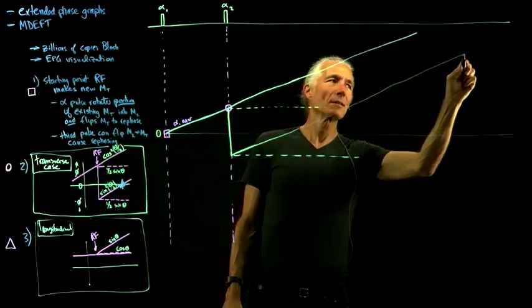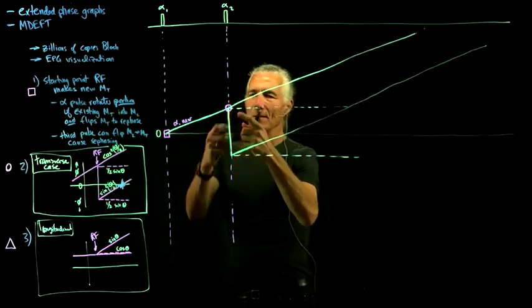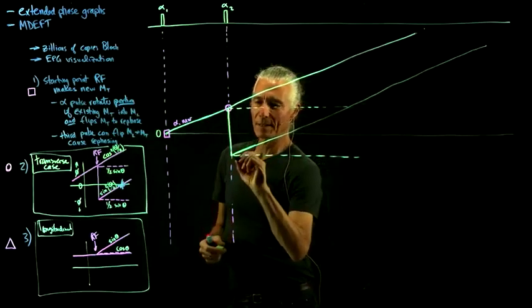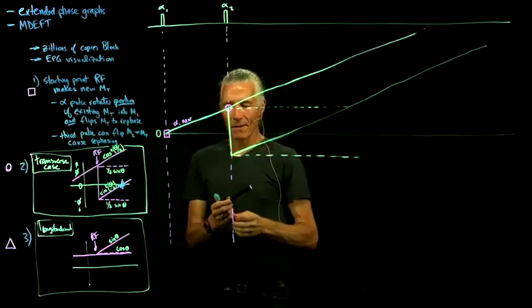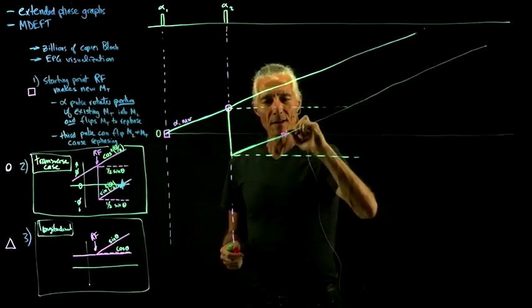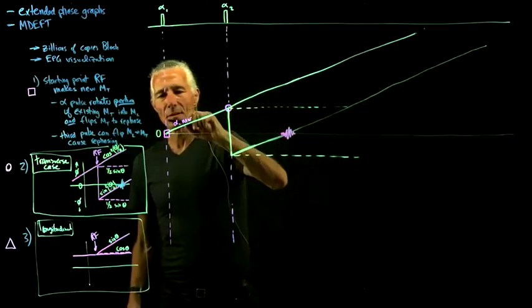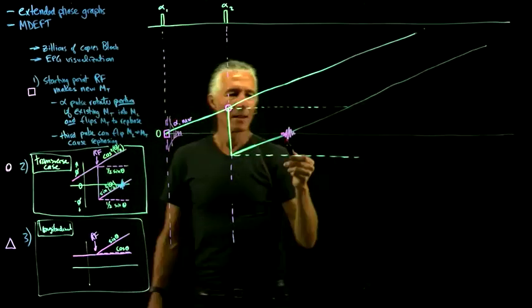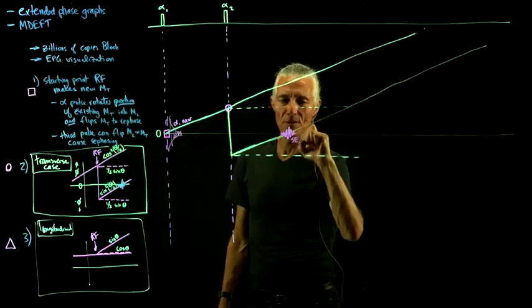So we cause some additional transverse magnetization to be flipped by 180 degrees so that it can rephase. So this is our echo pathway. And then when we reach that point, then we get our echo. So that's our first. So there's an FID here. There's the FID, and here's our first echo. So that's spin echo 1, 2.